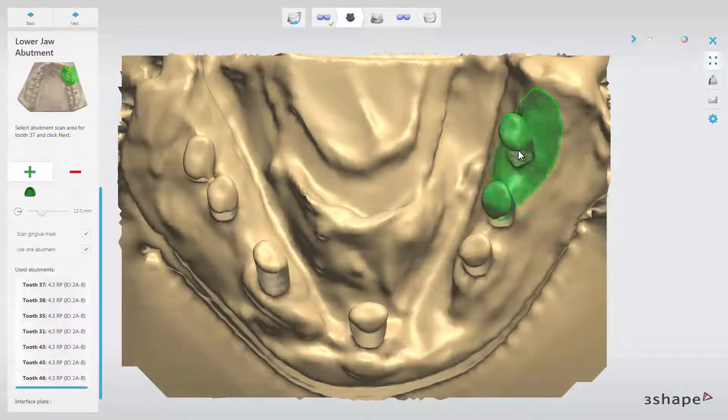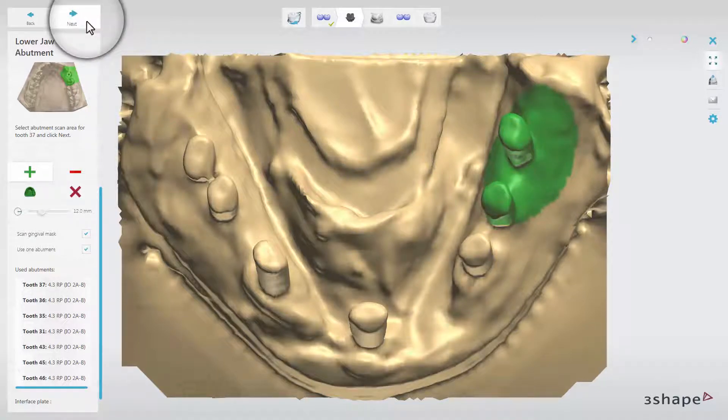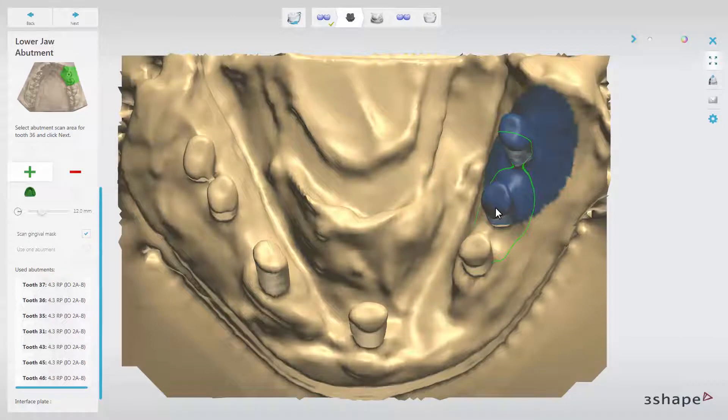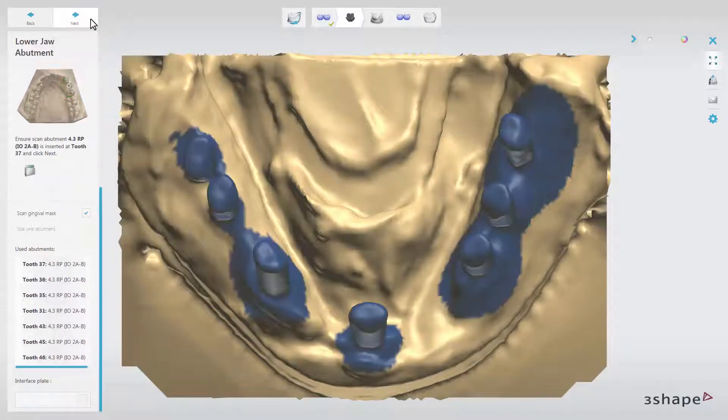Then insert the model into the scanner, scan it, and then take it out. Then unscrew the scan abutment and screw it into another implant replica, and repeat the same procedure as before for all the implant replicas.